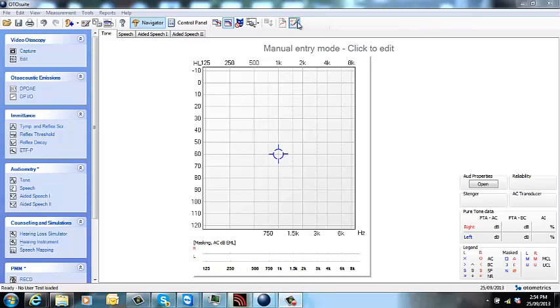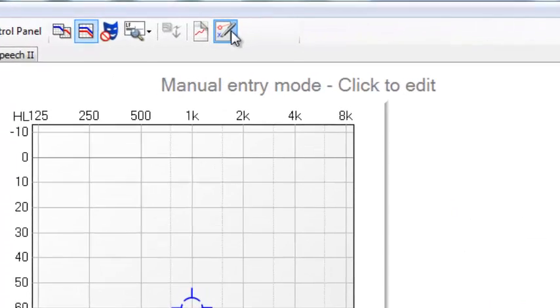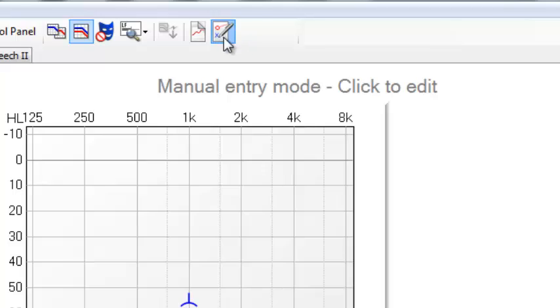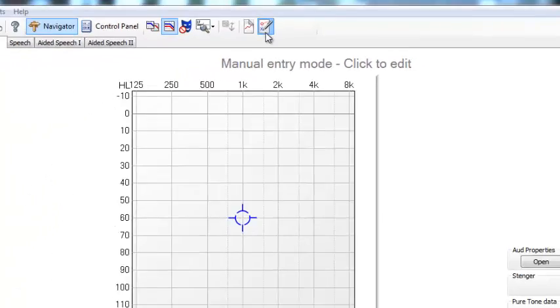First of all, what you need to do is take the manual entry mode off by clicking on this button here at the top.